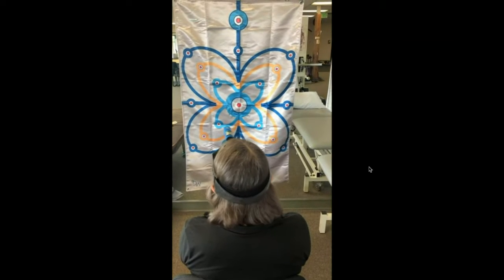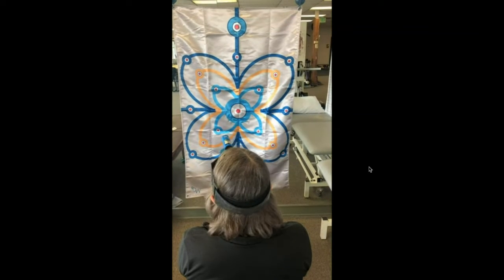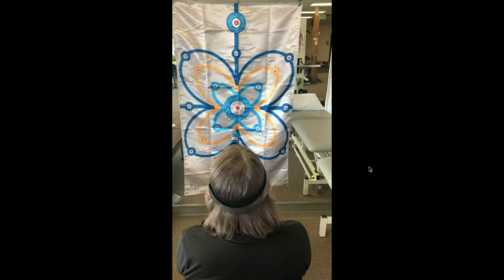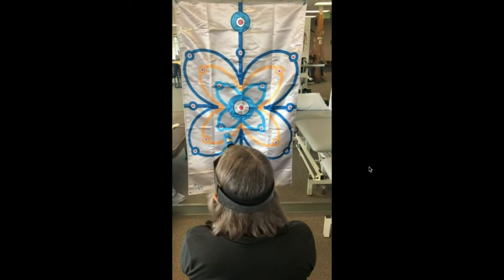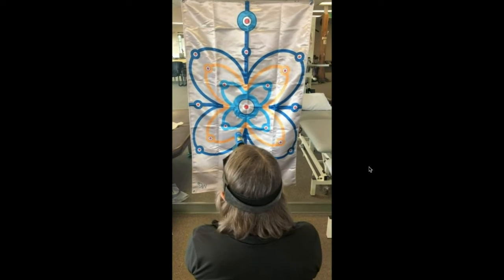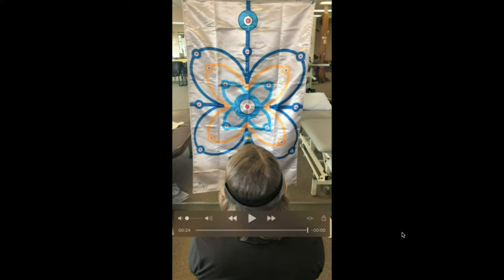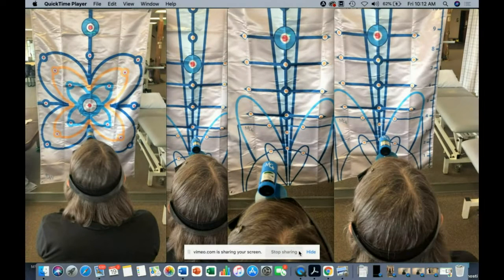Okay, so she's really irregular in her cadence, definitely irregular in her distance excursion from side to side. And she's got a lot of changes in the horizontal plane going up and down. So she's getting vertical at times, especially going toward the right. And she's just kind of all over the place. So if you can imagine in small movements of just walking around and having her look back and forth, a VOR representation of her fixation there and what her head can do, we start to get a better picture of why she might be feeling dizzy just walking around. All right, so that's one example there.